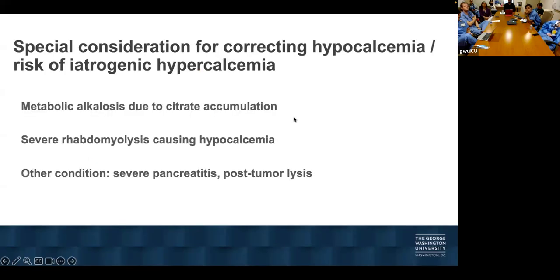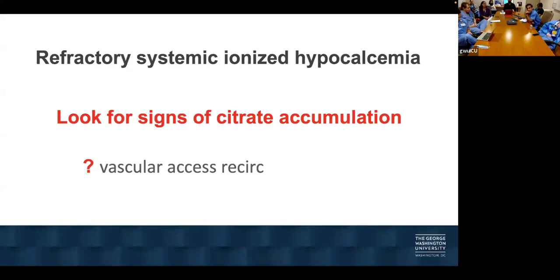If you're not looking at an accurate calcium, then you would have to have a peripheral. You can get it from the arterial line, since all these patients have arterial lines. For now, we told the nurses to get your ionized calcium from the arterial line, so nobody gets confused.